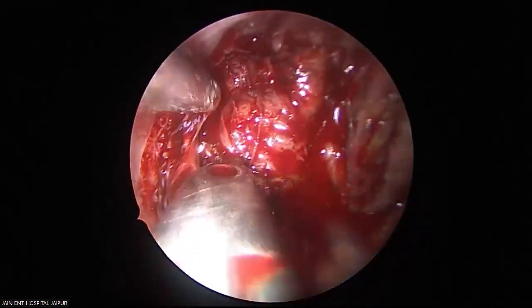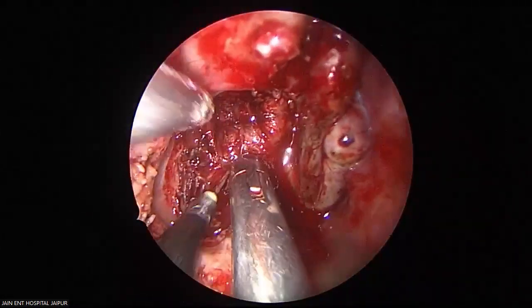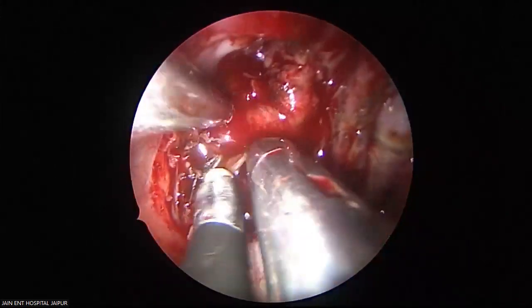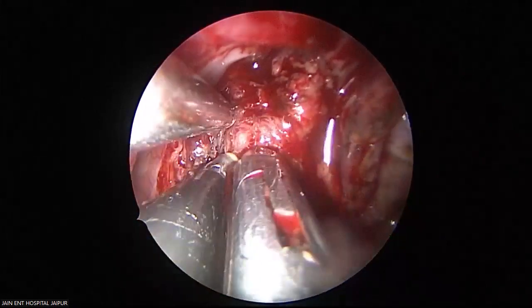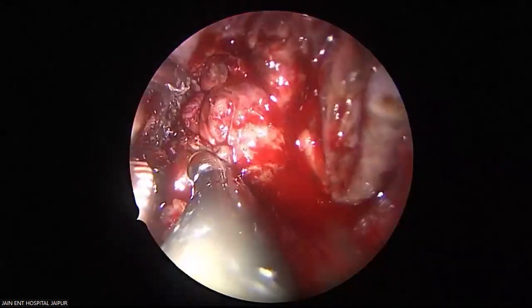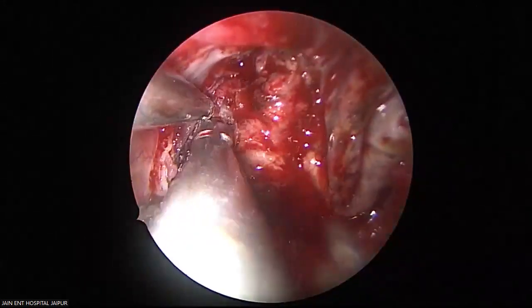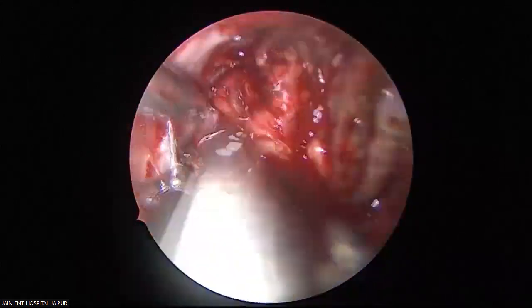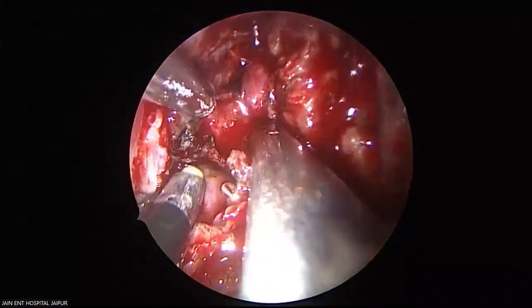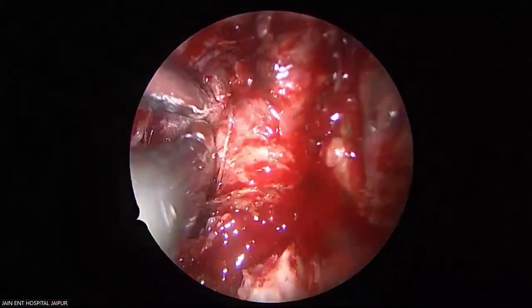Flip. Coagulate. I will coagulate this. Every such bleeder can take you to the main vessel.